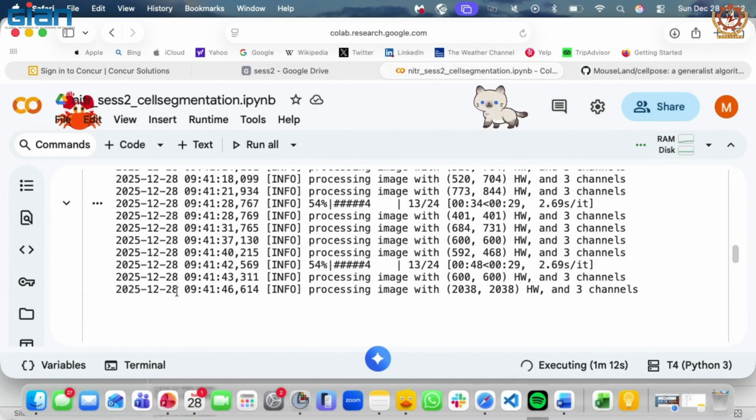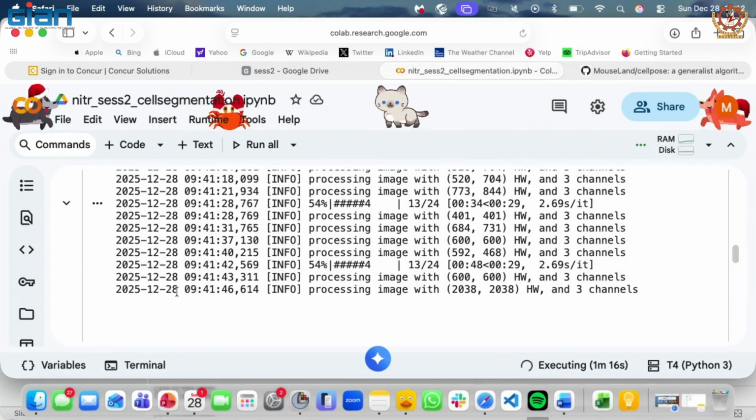So these models that we are talking about only do cell segmentation, but they still don't do cell classification, right? Dr. Prasanna was talking about whether this is a TIL, is it a cancer cell, or is it a non-cancer cell? Is it a fat cell? Is it a lymphocyte? What is it? To classify what this cell is, there are different algorithms. Those are cell classification algorithms. These are just segmenting the cells. It doesn't matter what the classes are.